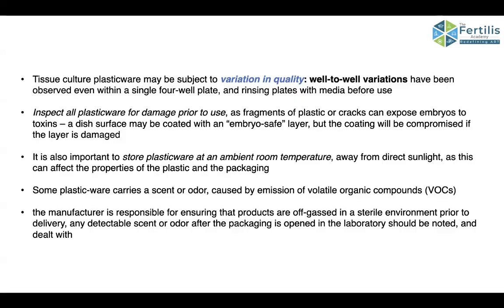It is also important to store plasticware at room temperature away from direct sunlight, as this can affect the properties of plastic and packaging. So when you receive the dishes in a box, open the box and try to keep the sleeves in a room at ambient air for at least 2 weeks. It will allow them to off-gas.